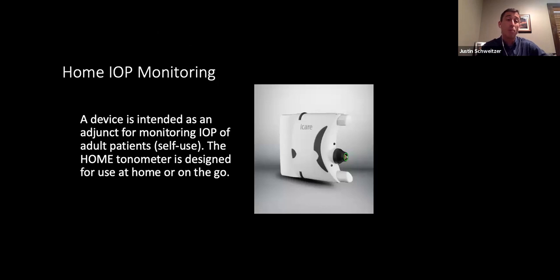There are IOP home monitoring devices. So the iCare Home is out there. We have utilized this a bit. I think this matters in more of a telemedicine, telehealth world that we may be living in for a while. And so these can be purchased. We rent them to our patients is how we do it. Patients can get them if needed. But how well utilized are these going to be? I'm not sure. But we do utilize these. We have 2 of them that we utilize and rent out to patients.